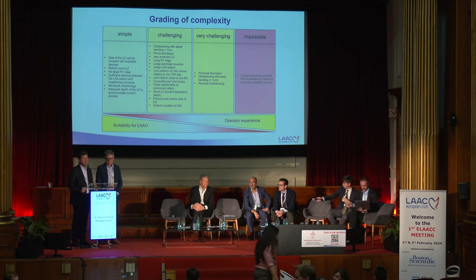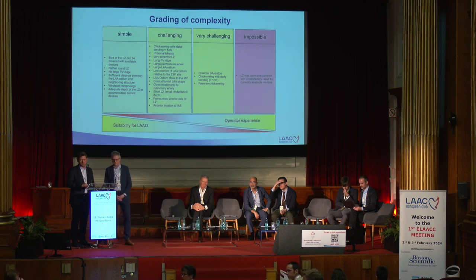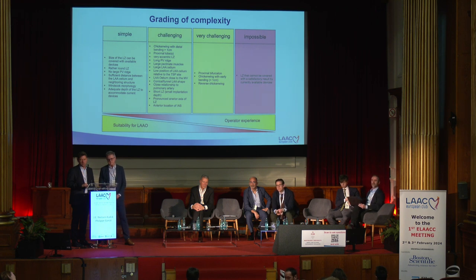I wanted to add a quick comment on this conical funnel-like shape, because I think it matters. There is something very simple proposed by the LifeTech IFU. I don't know if you're familiar with the old criteria. Old means ostium to landing zone discrepancy. If the ratio is over 1.5, it means that it's a conical shape and it's very simple. It's not perfect, but it's simple.